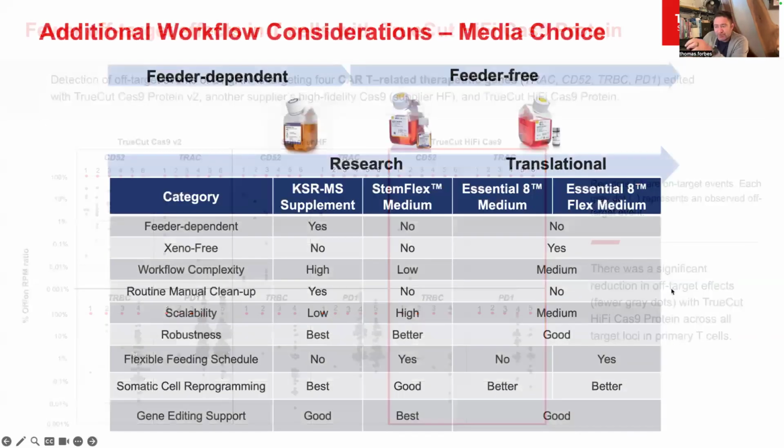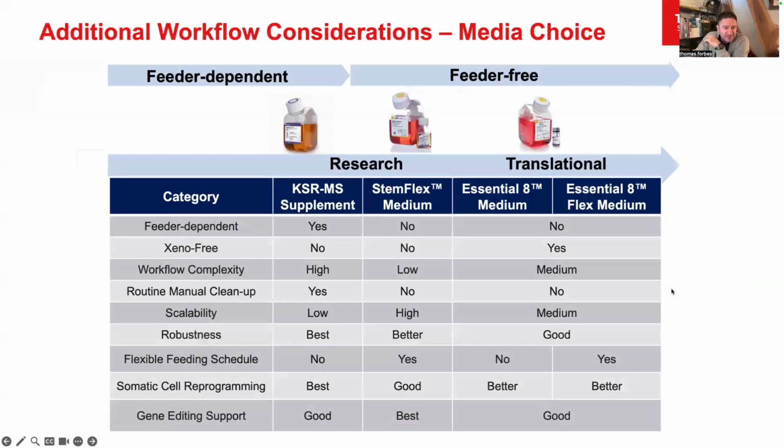Now, one other thing, and Omar talked a little bit about this last time around, but another important workflow consideration, especially when we're talking about things like gene editing, is media choice. And I'm totally admitting here, there's a lot of media choices, even within the same company. Sometimes it's totally overwhelming. But I think it's nice nowadays, in modern applications, to be able to choose specific media that work best for specific applications.